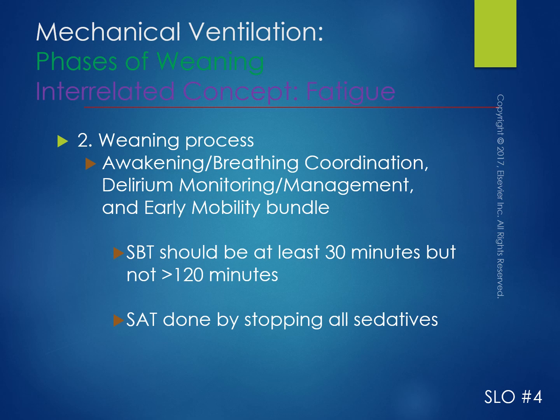So in those situations, we would put them back on support mode with the ventilator, be it ACV or SIMV, whatever they were on. And then the spontaneous awakening trial. At this point, we would stop all the sedatives because we want to make sure when they start breathing on their own that there's no sedation going on, because we want them to be completely alert and awake and able to do as much as they can breathing wise.